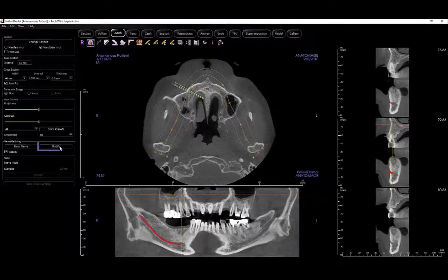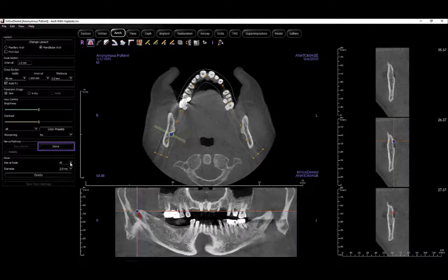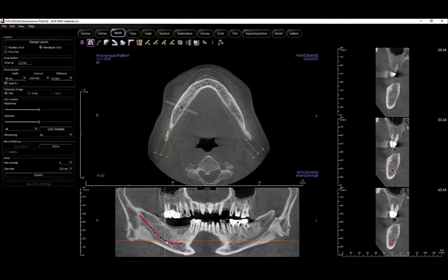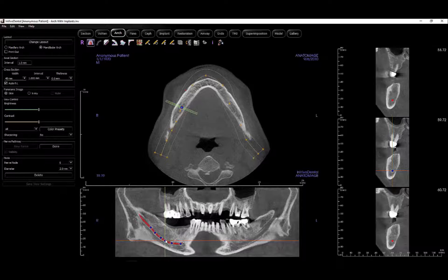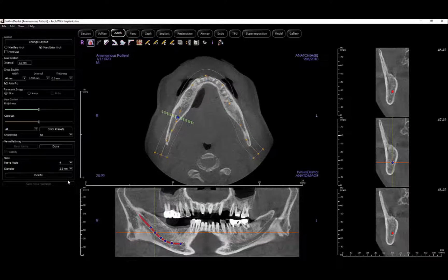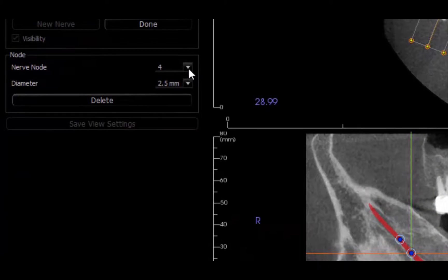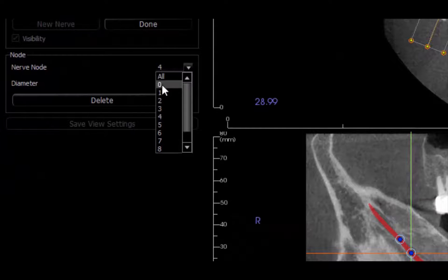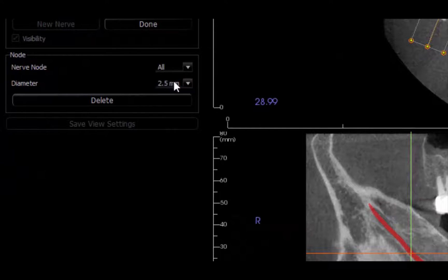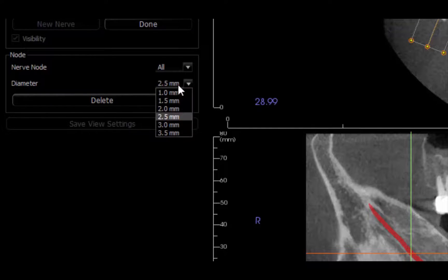You can modify the nerve by selecting it and clicking modify. Select a particular node either in the drop-down menu or by clicking on it in order to change its diameter, delete it, or adjust its position. Additionally, you can set the diameter for the entire nerve by selecting all from the drop-down menu.